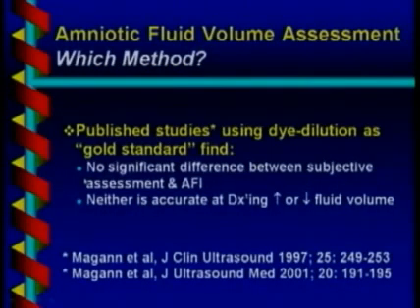So which method should you use? Well, there have been a couple of published studies that have used dye dilution as the gold standard, and then compared the gold standard to subjective assessment or amniotic fluid index. What these studies have found is that there's really no significant difference between subjective assessment and amniotic fluid index when you compare them to the gold standard.